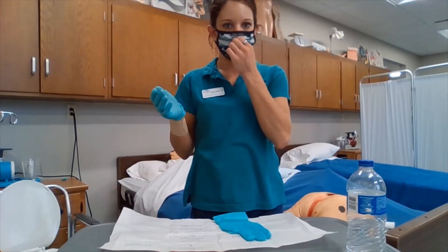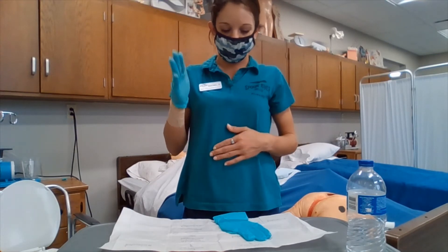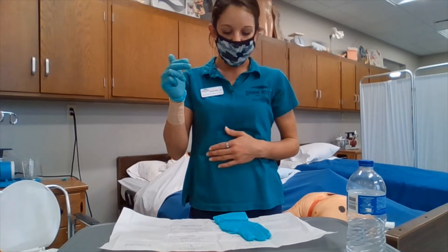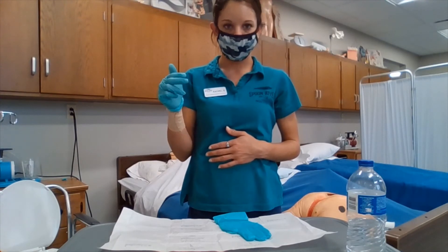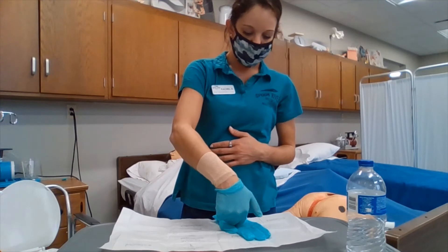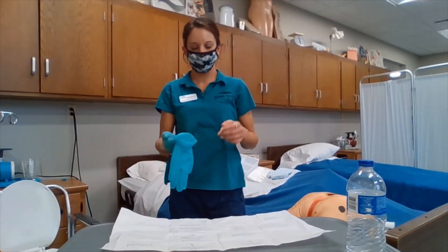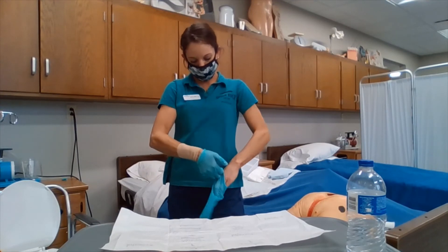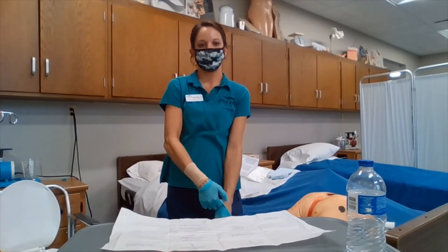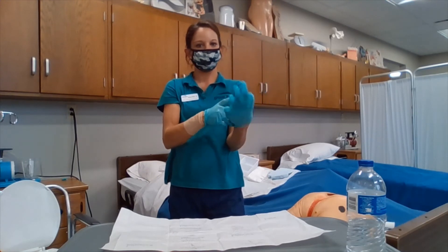We are now ready to apply the other glove. Sterile touches sterile — we are going to place our gloved hand on the inside of the cuff, and we are going to be stepping away from our sterile field and inserting our non-dominant hand, keeping it above the waist.